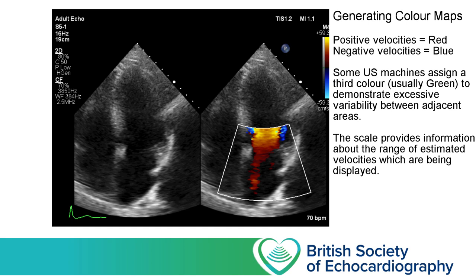So here we are in our apical 4 chamber view with two images side by side. On the left we have the plain 2D image, and on the right we have an identical image with a colour box overlaid. You can see from the ECG that the image is frozen at mid-diastole — towards the tail end of early diastolic filling. We can see a band of dark red becoming bright yellow blood leaving the left atrium and entering the LV. The scale on the right hand side indicates the ultrasound machine is estimating this blood is travelling in the order of about 50 cm per second as it crosses past the mitral valve annulus.